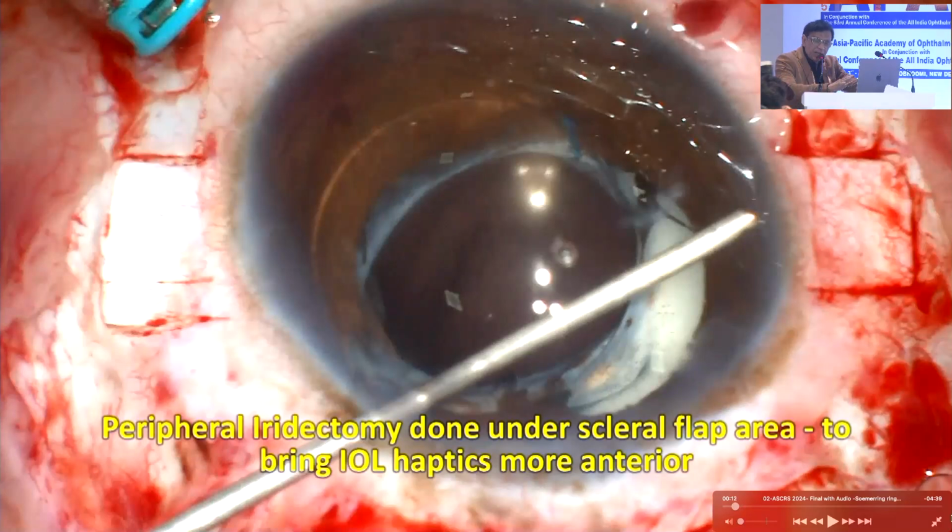So let's ask the panel, and whenever I tell a patient like this, I'll make him all right, you can imagine how bad it will go. So panel, let's ask David perhaps, who is our guest here. David, we have a patient there with Soemmering rings present. So the question comes, there is no capsule obviously there, the posterior capsule is gone. That lens is badly subluxed. How do I remove those Soemmering rings now?